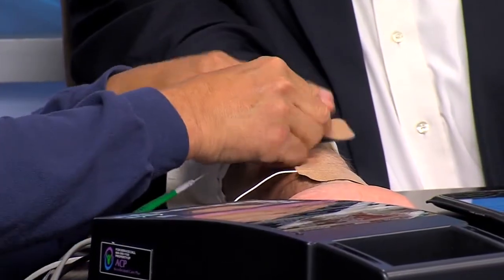Okay, now, we're going to get to the physical therapist part of this whole thing. I'm going to be your test patient, okay? Okay. So, can you hook this up to me and show? Absolutely. Show me how this works? Now, you said high voltage, right? I did, but don't be afraid. It's okay. It's not a big deal. It's great. I'm not going to go jumping out of the chair or doing anything. No, we hope not. All right, what are we doing? Okay. So if you were to have a wound on your arm, okay, and the wound was there, we would hook you up below and above the wound.